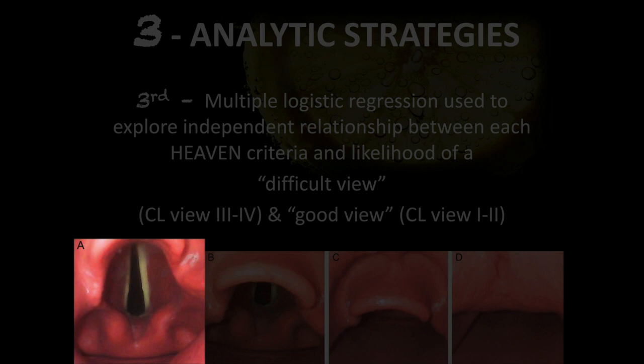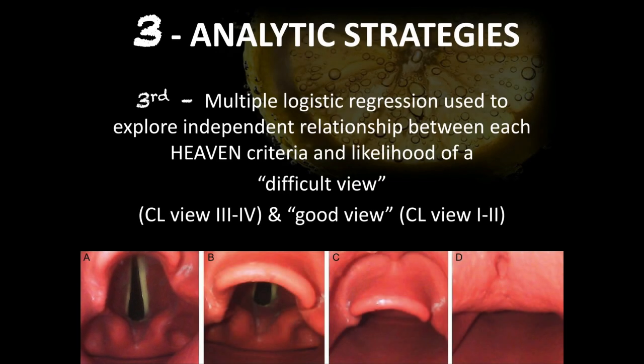And so even though you might see this perfect view on A with a video laryngoscope, what's happening is you're probably too close. The distal tip is right up against the cords. The camera sits a little bit off of that distal tip. And so when you go past with that ET tube, you're unable to pass it. So what we really focus on is understanding that a little goes a long way.